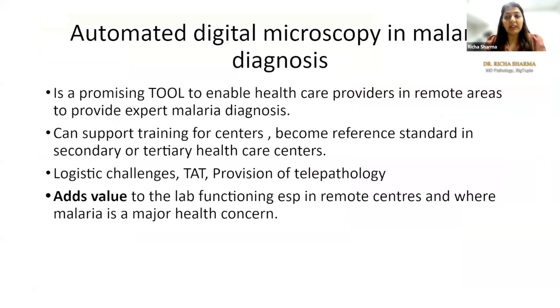It will enable healthcare providers in remote areas to provide expert malaria diagnosis. It can support training. It can become a reference standard. It will also circumvent logistic challenges, especially in areas where RDTs, rapid diagnostic tests, are not easily available. It will also improve turnaround time. And automated digital microscopy gives you a provision of telepathology. So you can bridge the gap where the expert is needed but is not present, and where the expert is present but can't provide his services there.